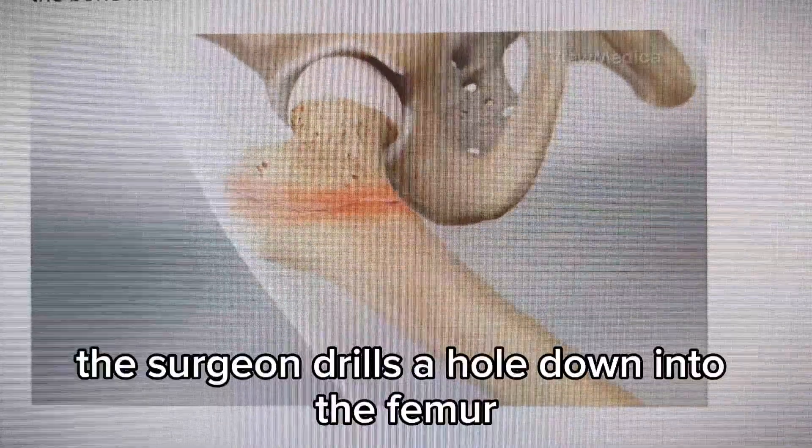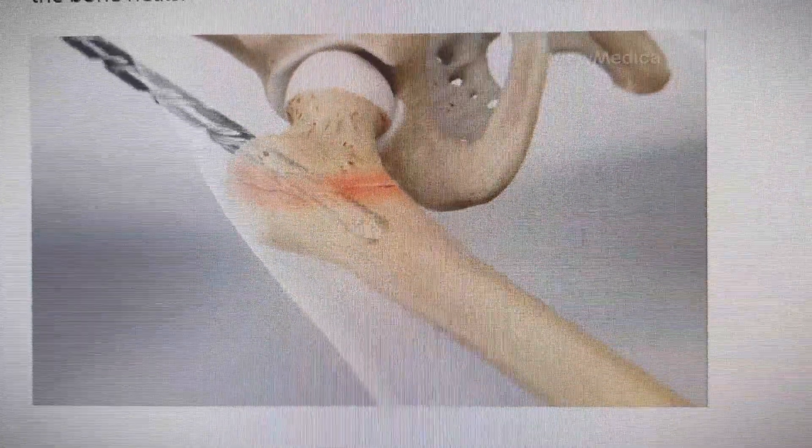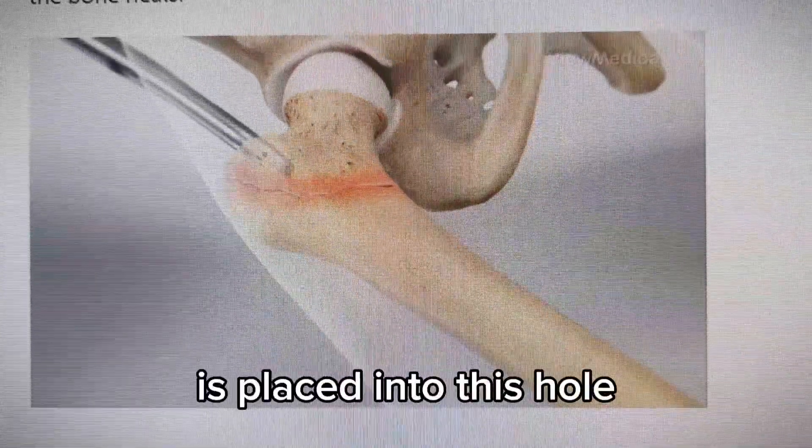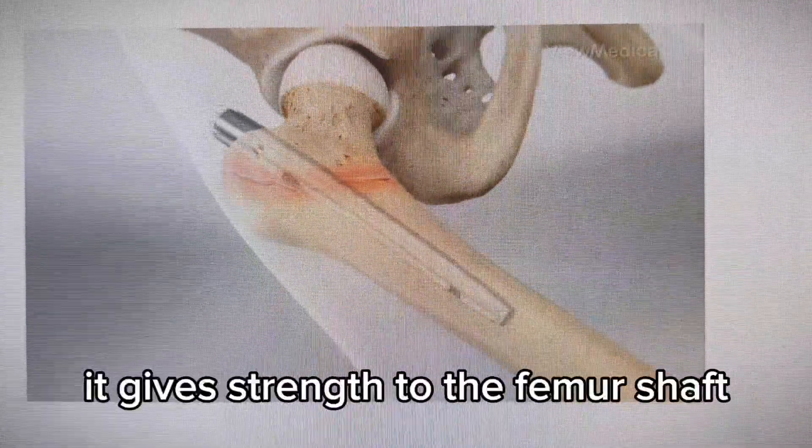The surgeon drills a hole down into the femur. A rod implant, called a nail, is placed into this hole. It gives strength to the femur's shaft.